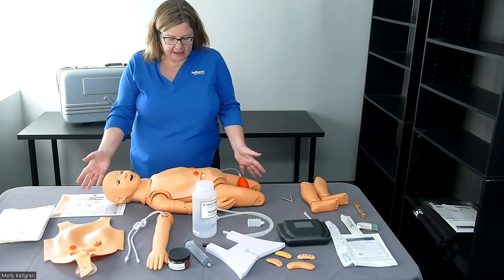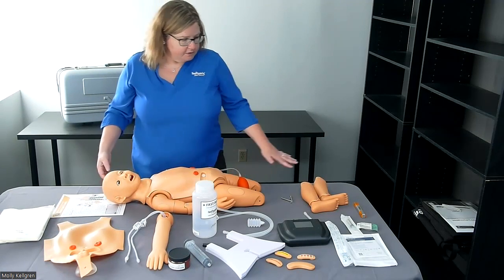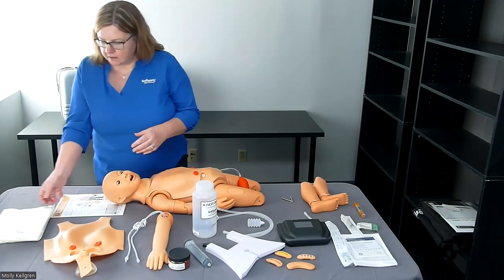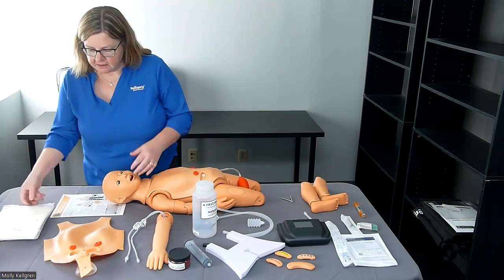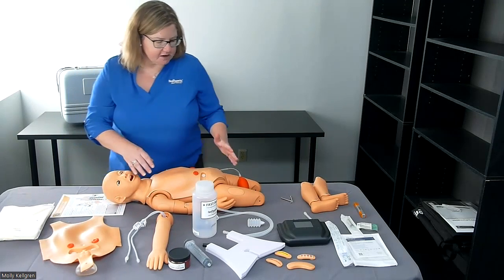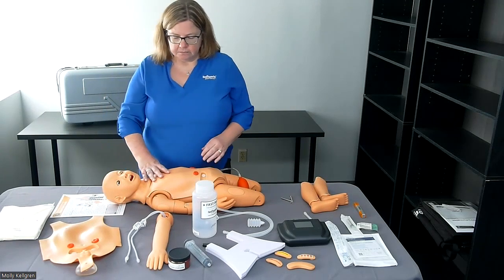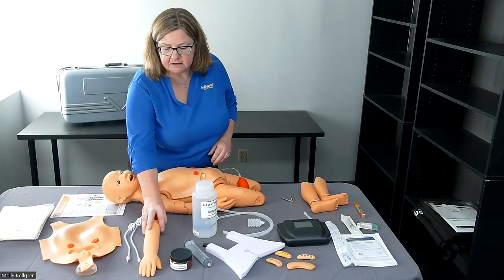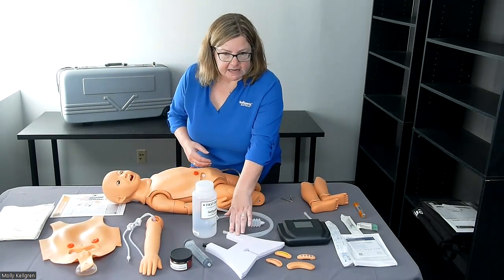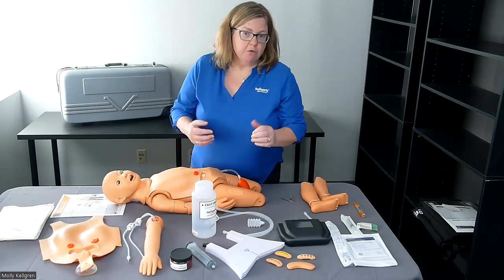So what comes with it? You have your pediatric nursing mannequin torso. We have the legs that attach to it and we'll show you how to attach those. We have pajamas. We have the interchangeable genitalia — the entire chest plate comes off. Right now we're set up to be a female, but we can change it over to a male. We have a separate venopuncture arm.